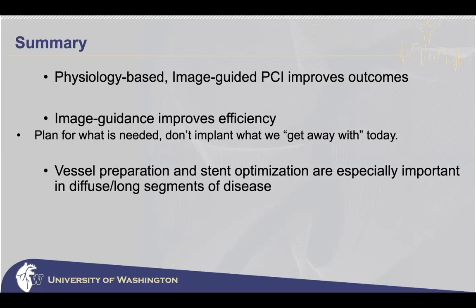Finally, vessel preparation and stent optimization are particularly important in long segments of disease because of risk factors for stent failure. And it's really incumbent upon us, particularly in these cases, to gain as much luminal area as possible, get the patient a good result.